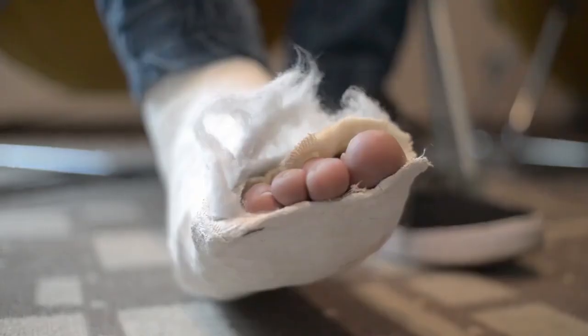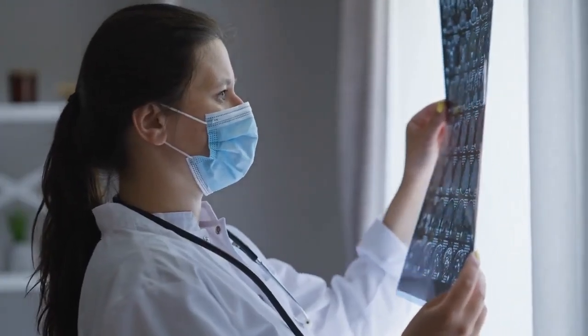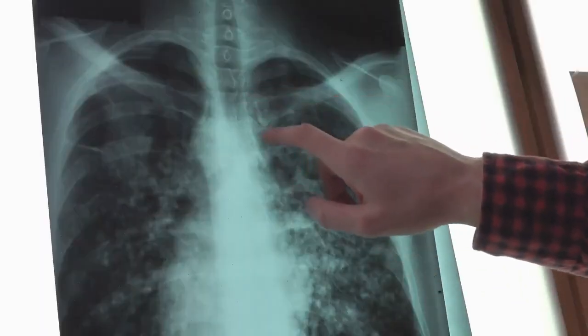Now, there are some times where a doctor might refer a patient to me and it just says weakness. That's not the most ideal way to approach nerve conduction testing with the patient, because it's kind of like an X-ray machine. Let's say you have a broken leg. If you are sent to the radiology department and they have no idea why you're there, they just have X-ray machines, and they do a chest x-ray, but you have a broken leg, it's not going to tell your doctor anything about your broken leg, right? So how a test is ordered, how that test is applied, is just as important when it comes to nerve conduction and EMG testing.